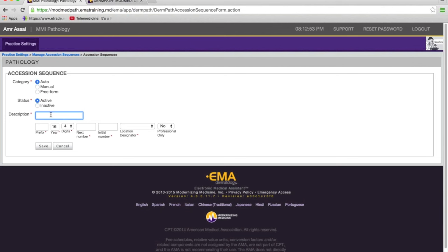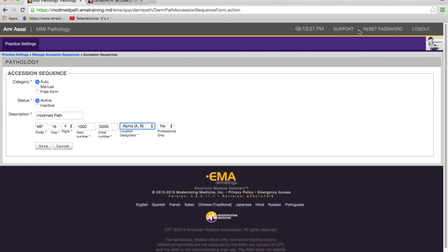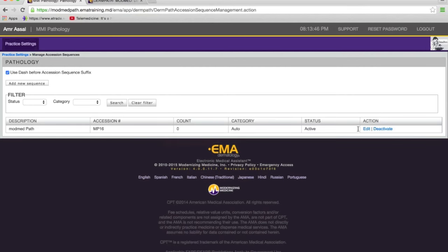Let's create an auto sequence. I'm going to give it a description and a prefix. The year is 16; I'm going to make it a four-digit sequence starting at 1001, so I'll put 1000 here. Next year when 2017 comes, I want it to start at 1 — EMA takes care of that automatically. EMA generates requisitions with body locations using letters, and we support both letters and numbers in the pathology module. We're doing both technical and professional in this scenario, with no 26 modifier. Now I'll save. And there is the sequence created — category auto, it's active, and you can always deactivate it.